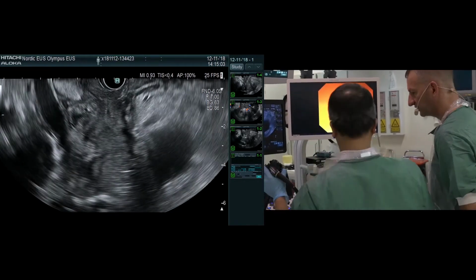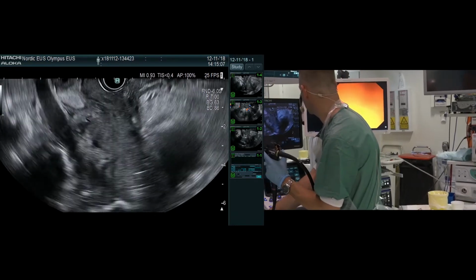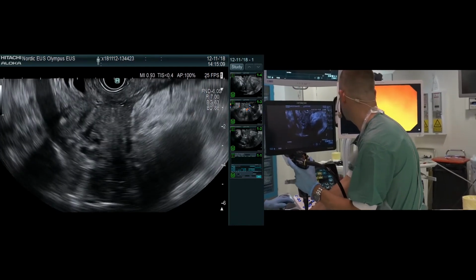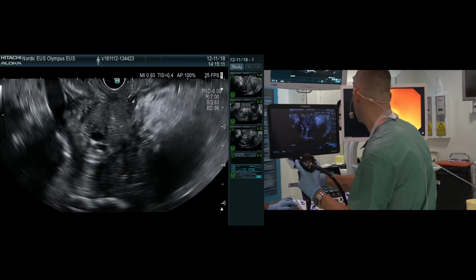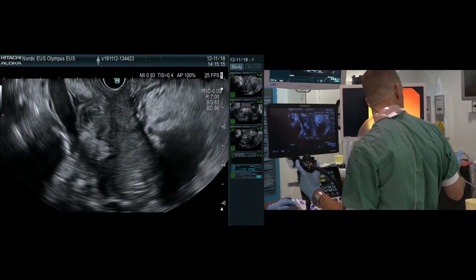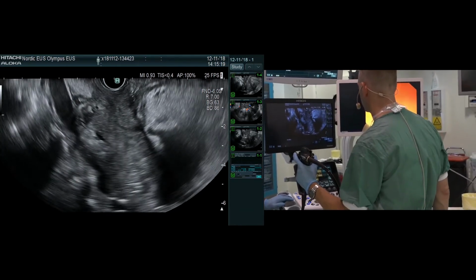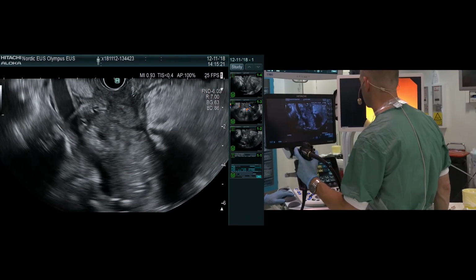We have a question for you, Thomas. It's very likely that I was not in the tumor, I think, actually. So this is a better situation. Yeah, hello? Thomas. Yes. I'm just giving a question, because now we've done the biopsy. It seems that there is a mass, at least in the pancreatic biliary area. So the big discussion today is, should we in this case go for an ERCP, or can we plan to go for a choledochoduodenostomy?